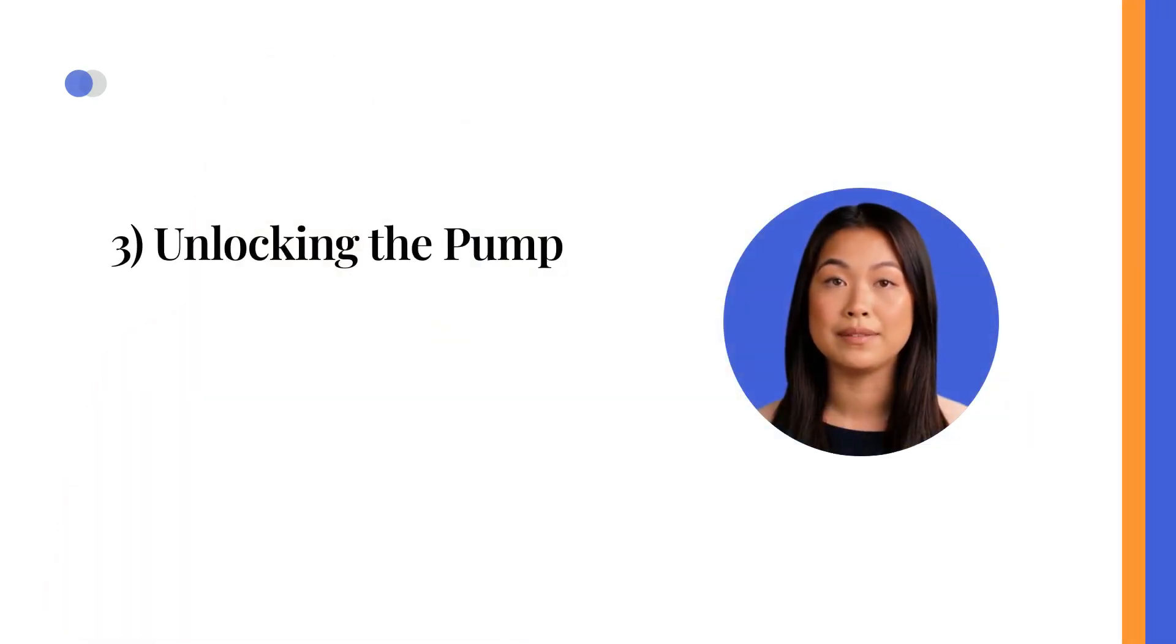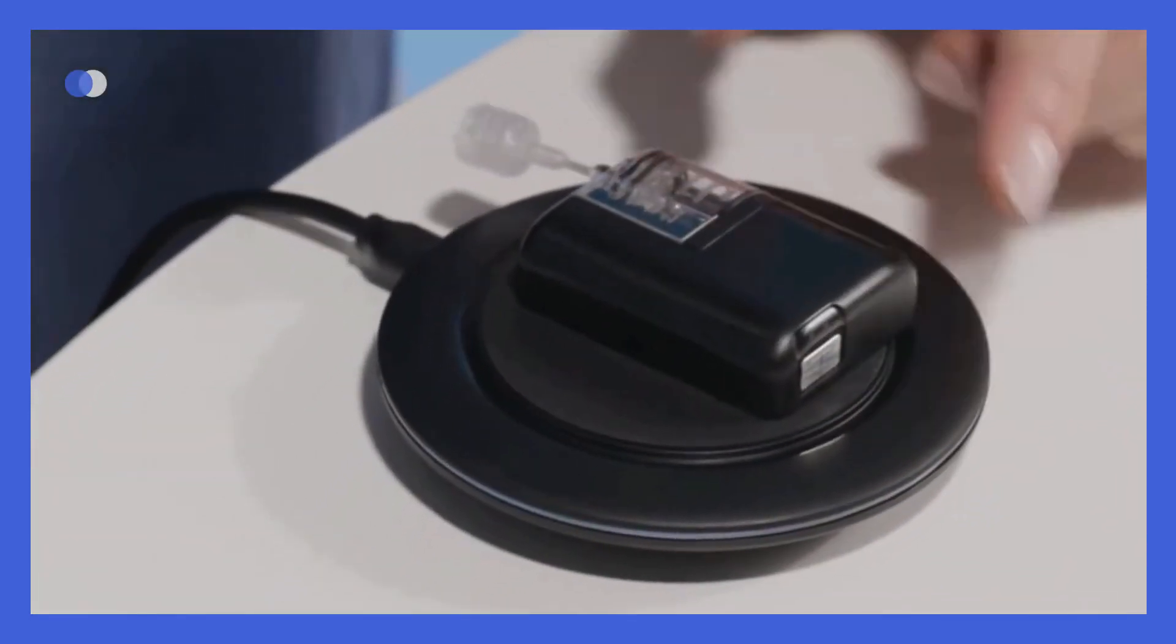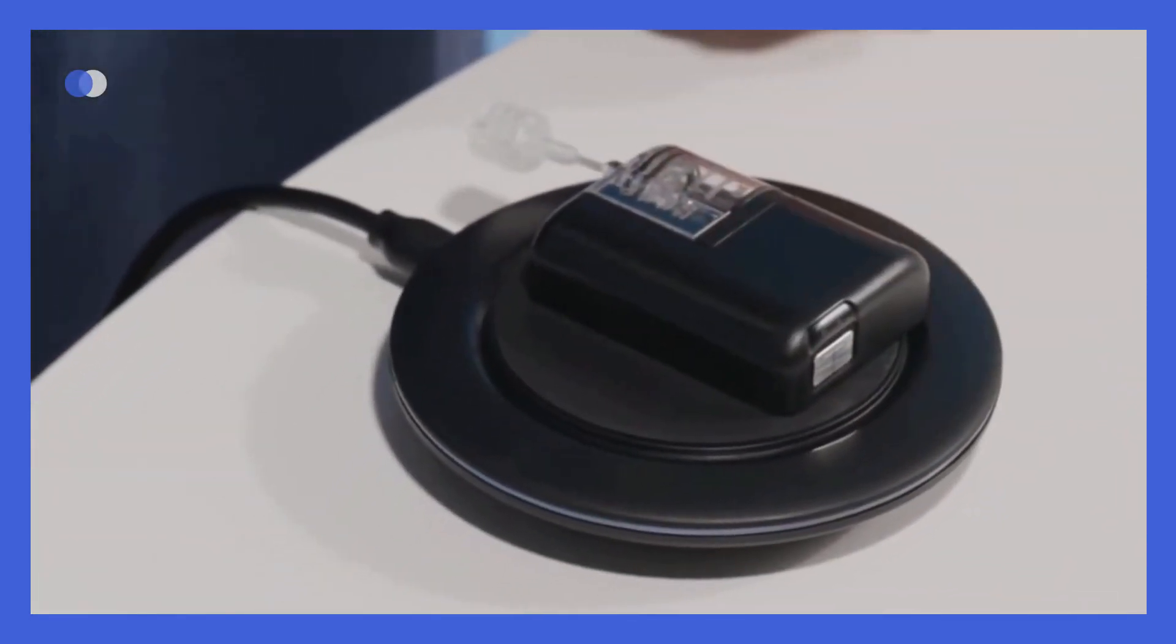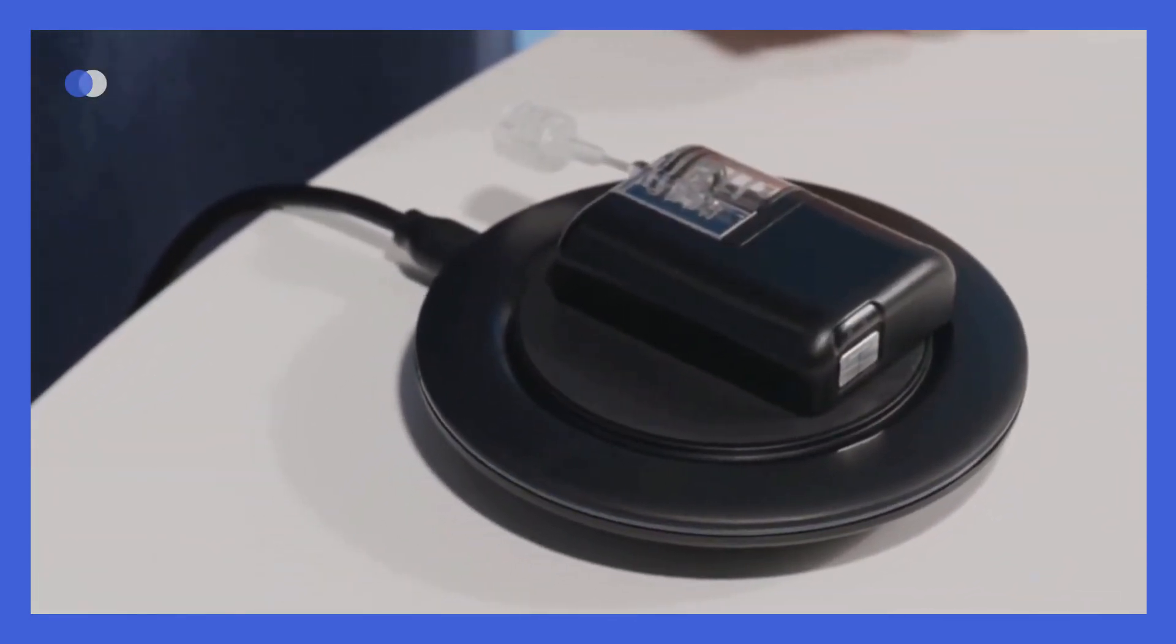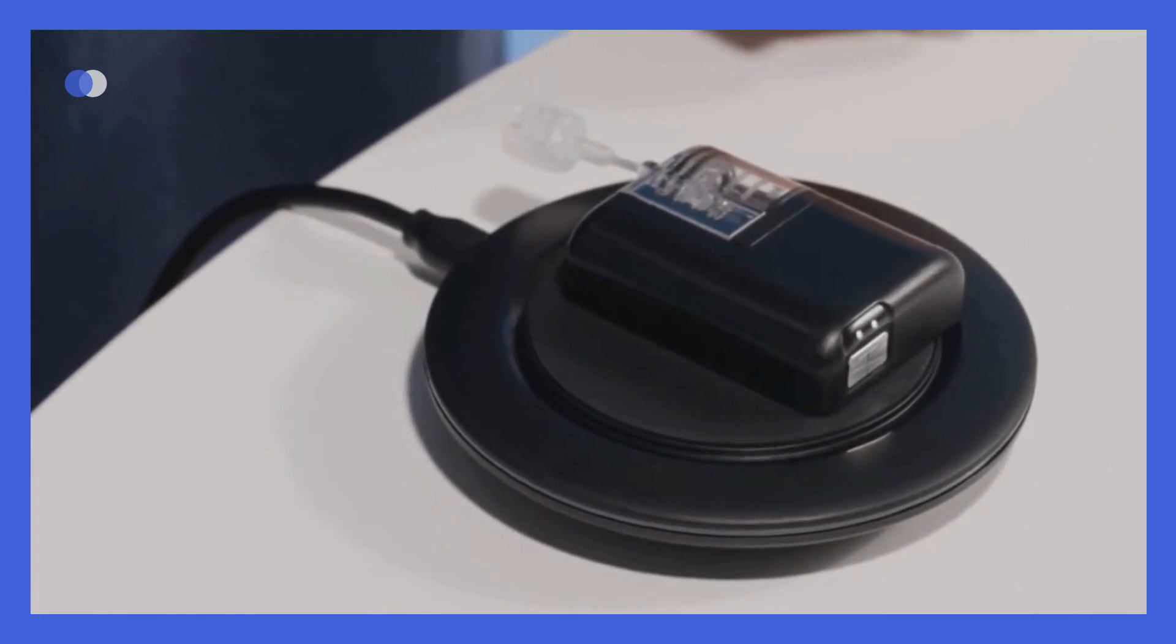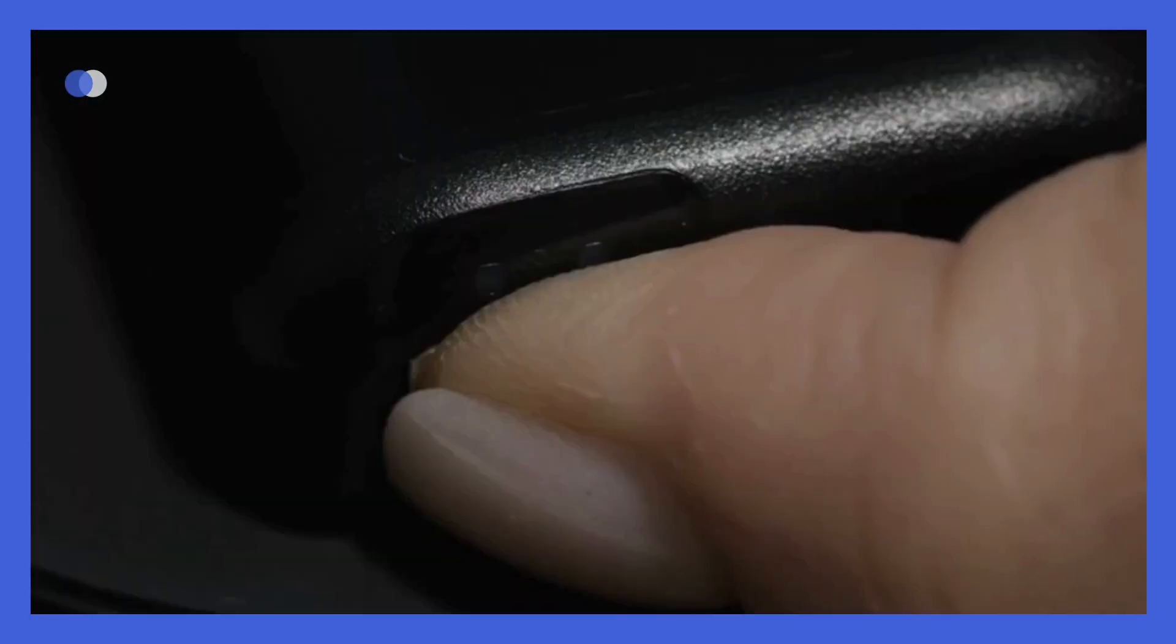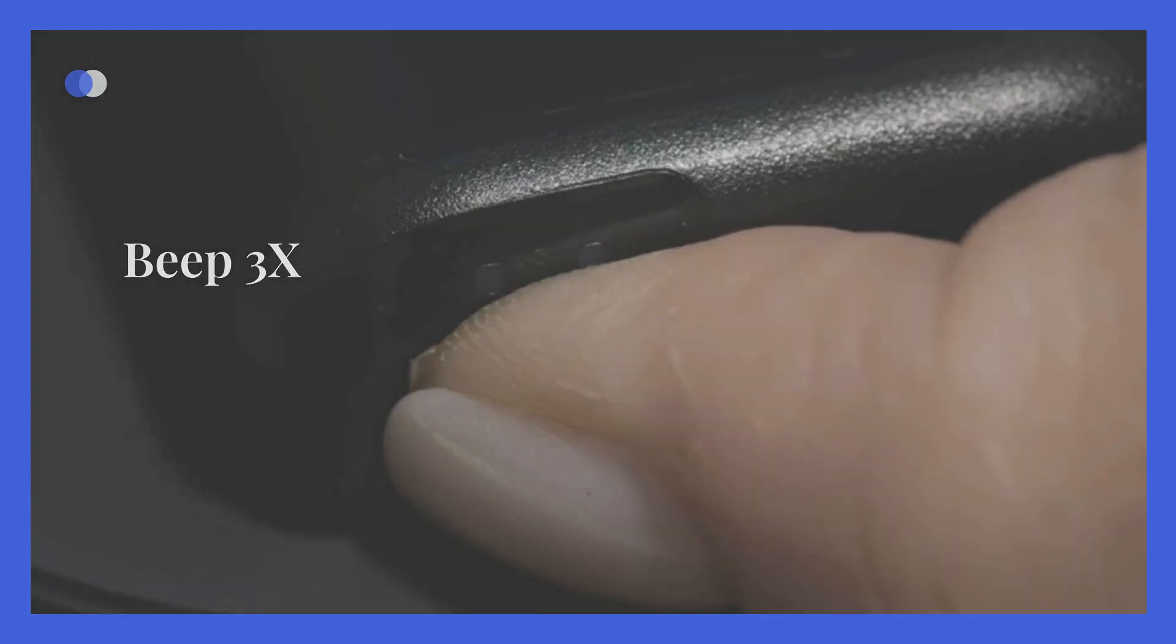Unlocking the pump. Next, we'll proceed to show you how to turn the pump on and off. To turn the pump off, place it on the charging pad and make sure the logos on the pump and the pad align. Don't worry if it looks a little off-center. Now hold the pump button for 20 seconds. The pump will beep 3 times before it will turn off.